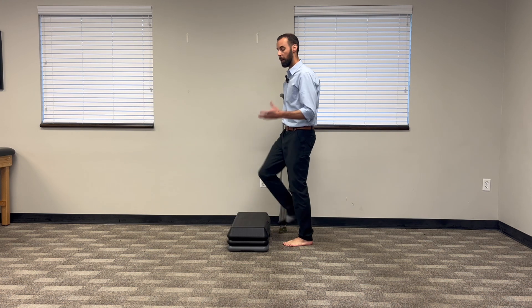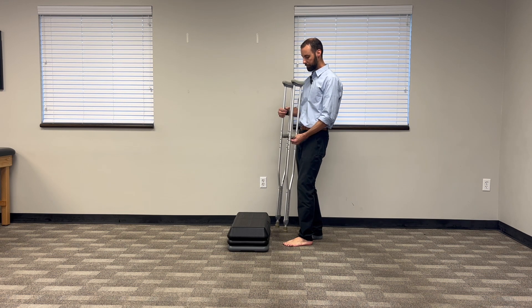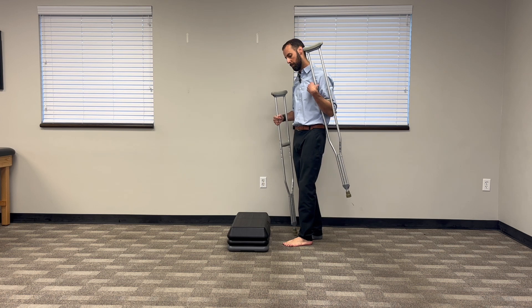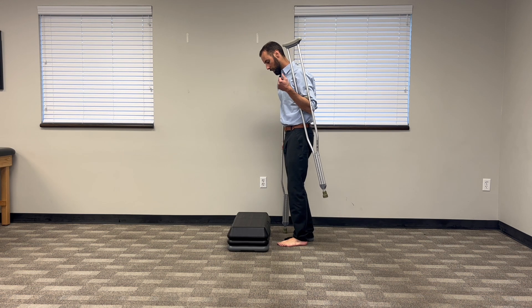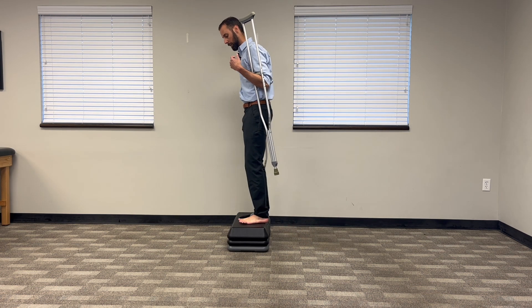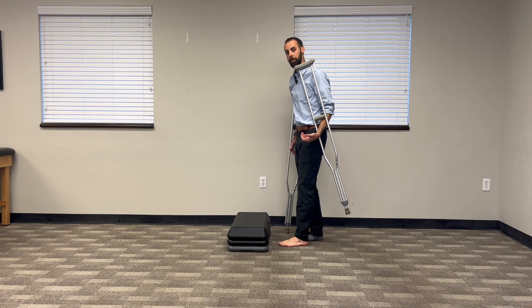Now let's say you have smaller hands and you can't hold them both in one hand. I have a lot of people who will just hook one underneath their arm like that and use one crutch on the opposite side of your injured leg. Then you just go up with the good, just like that. So your other one's just coming along for the ride, and you're just using one crutch to support yourself.